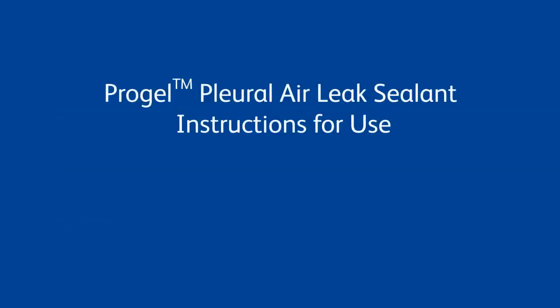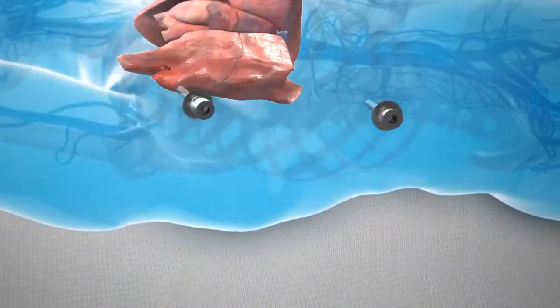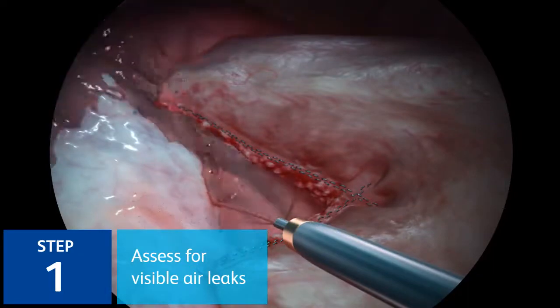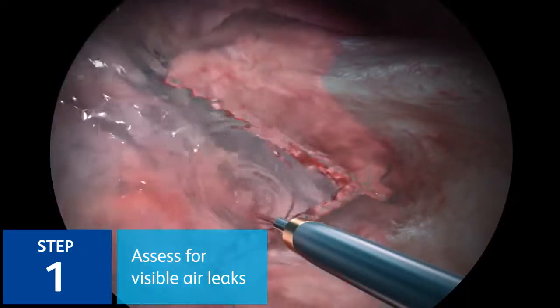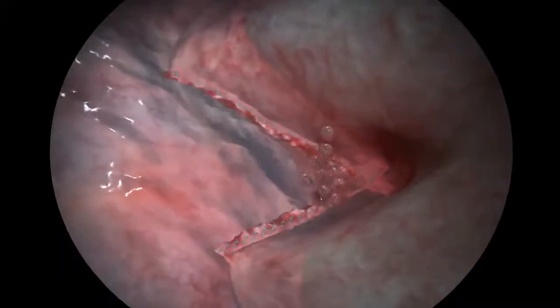Progel Pleural Air Leak Sealant Instructions for Use, Part 2. Sealant Application. Step 1. After applying standard suture or staple closure methods to seal identified air leaks, assess for persistent visible air leaks from the visceral pleura.